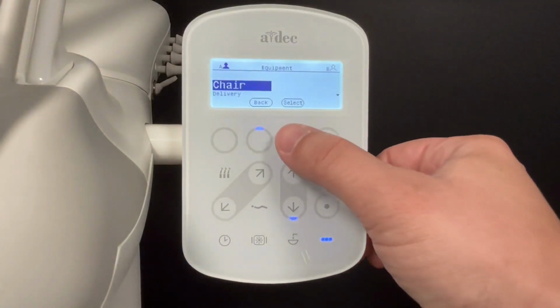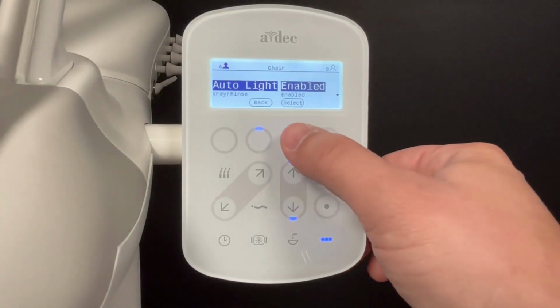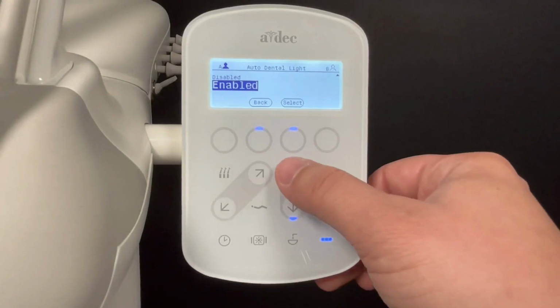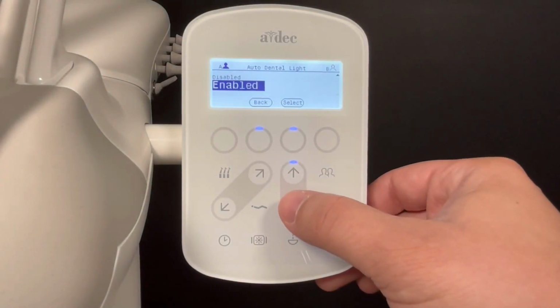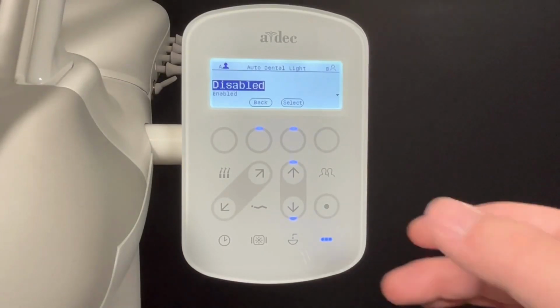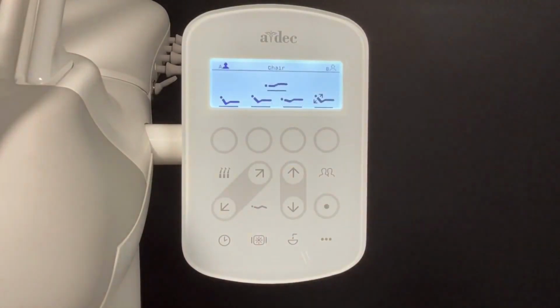Then select Chair. Select Auto Light. Use the up and down arrows to cycle through the options. Press Select to save the setting. Use the chair icon to exit the menu and return to the main screen.